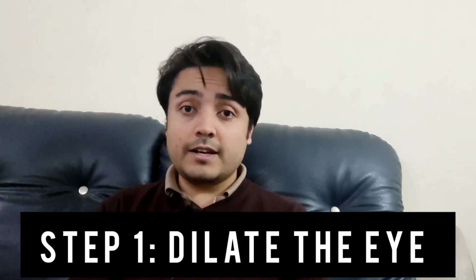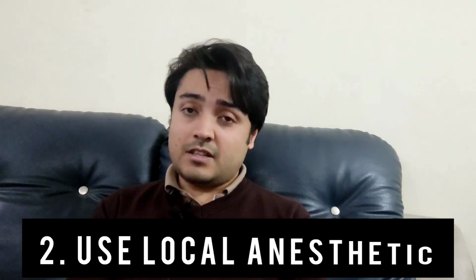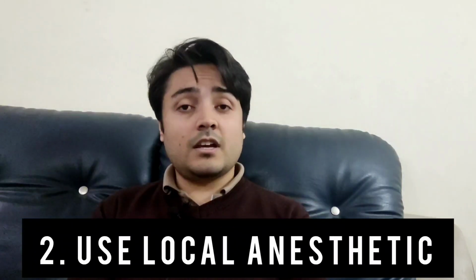Now first you should dilate the eye. For that you can use various parasympatholytics such as atropine, or sympathomimetics. Once the eye is dilated, you have to anesthetize the eye. Now for anesthesia, it's local anesthesia. That's the beauty of it.